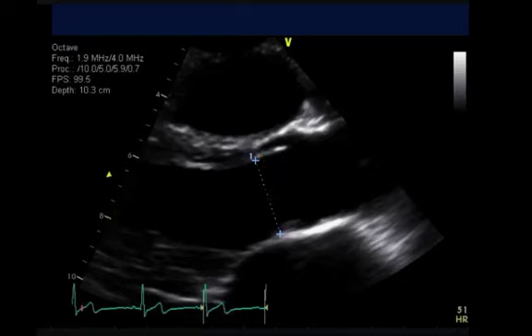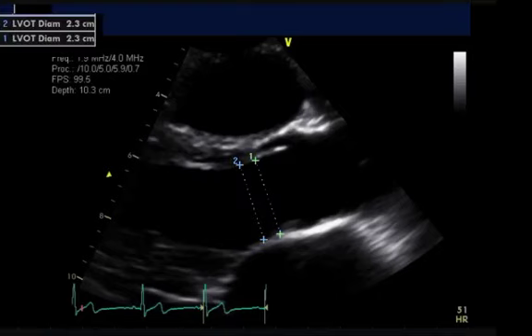An alternative method for measuring the LV outflow tract diameter is to measure 5 mm from the annulus. So we would place the anterior caliper around this point here and the posterior caliper placed around this point here, again ensuring we are aligned parallel with the aortic annulus. We can appreciate these measurements are essentially the same, and this is because in theory the LV outflow tract is cylindrical in shape. The method I prefer is Technique 1, as you can see good anatomical landmarks which assist us in correctly placing our calipers. Method 2 can prove challenging, especially in patients with a mitral valve replacement.